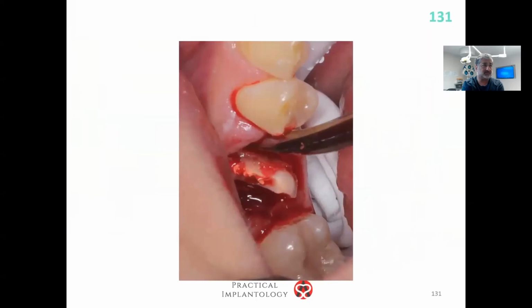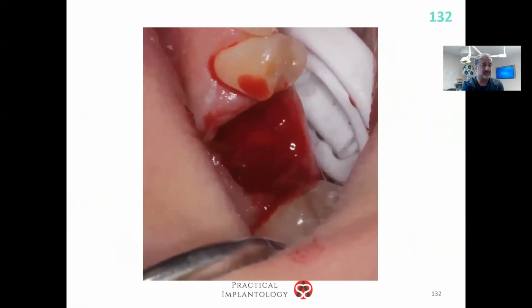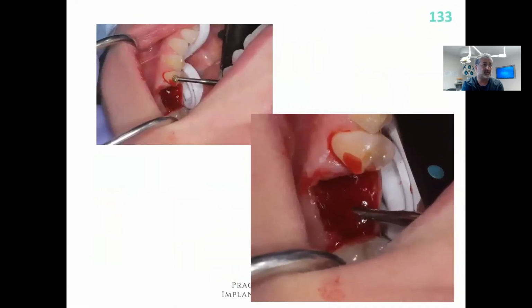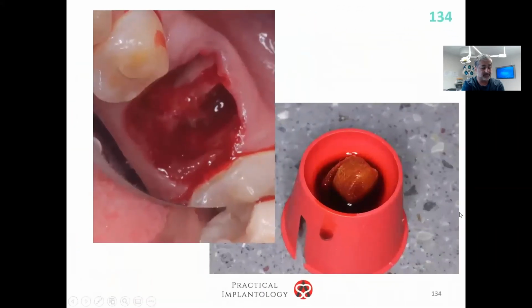Again, I twist, and it would come out. Again, we got a nice socket there. The buccal plate is present. I will then degranulate with copious saline. Degranulate at 1200 to 1600 RPM, depending on what type of bone it is. Higher with harder bone. Copious saline. You don't want to overheat this bone.